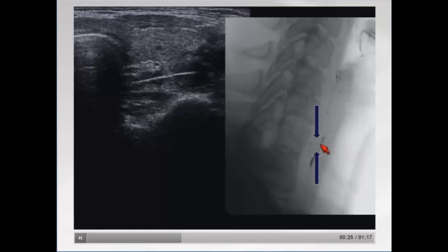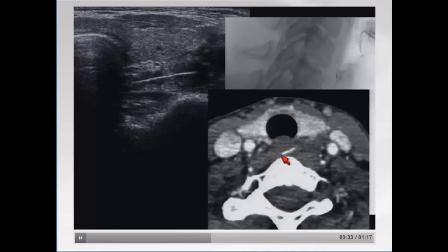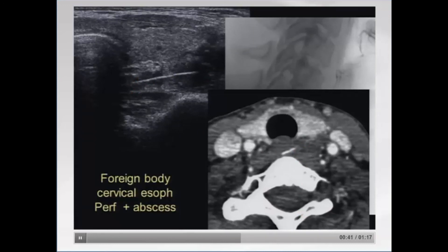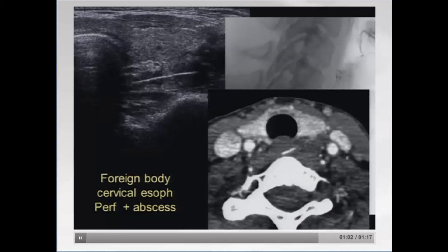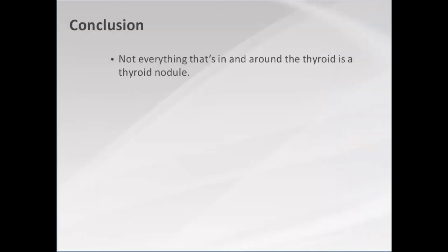She came to the hospital, had a barium swallow — a little hard to see — and then a CT confirmed it. Honestly, I think you can see it much nicer on ultrasound. This was a foreign body in the cervical esophagus that had perforated it and created an abscess. The foreign body turned out to be a wire bristle from a brush used to clean a grill. Her husband cleaned the grill, put the steaks on, and she swallowed the wire bristle with her steak. Three or four days later she came in with the abscess. The concluding lesson: not everything in and around the thyroid is a thyroid nodule.